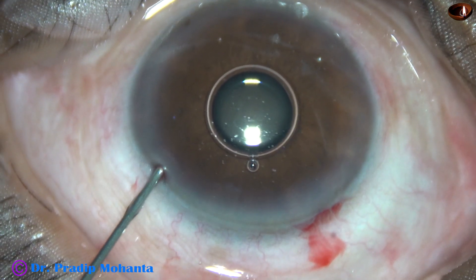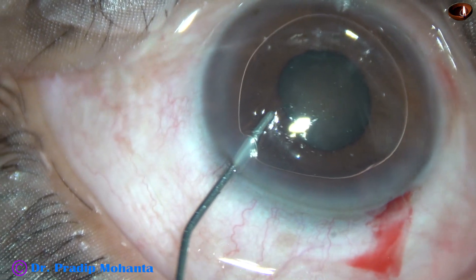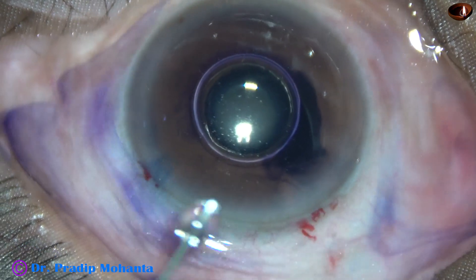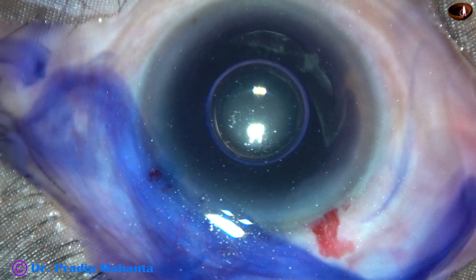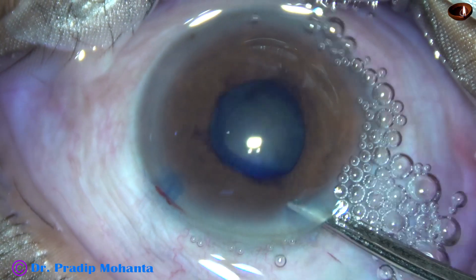An air bubble is injected into the anterior chamber, and beneath this air bubble, trypan blue dye is applied over the anterior capsule. This is a bit of adrenalin. In this case, adrenalin had no effect on the pupil — the pupil didn't budge.